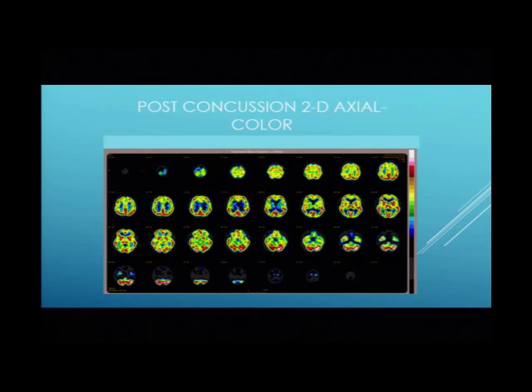Here's the bottom, and that's the back of the brain, the cerebellum, that always has the highest flow. As you start to come up here, you see some irregularity, and there's their flow scale. Actually, it's a more complex flow scale. The other one was 10 steps. This is 20, 23, or 24. And you see the same kind of irregularity. You see it here, here, and there. That's the front. It's getting towards the top, and actually goes all the way to the top. So those are the axial views from the bottom up.